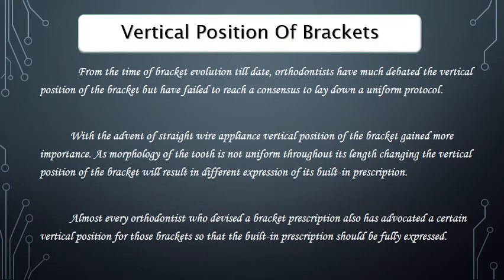Vertical position of brackets. From the time of bracket evolution till date, orthodontists have much debated the vertical position of the bracket but have failed to reach a consensus to lay down a uniform protocol. With the advent of straight wire appliance, vertical position of the brackets gained more importance, as morphology of the tooth is not uniform throughout its length.